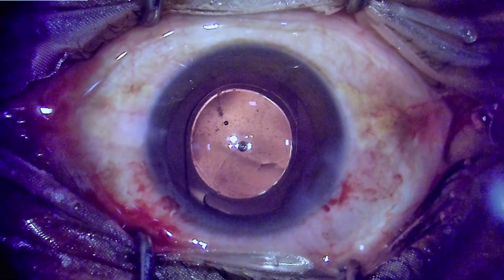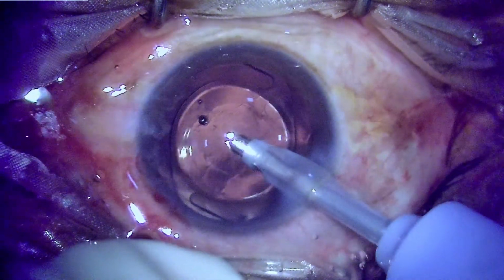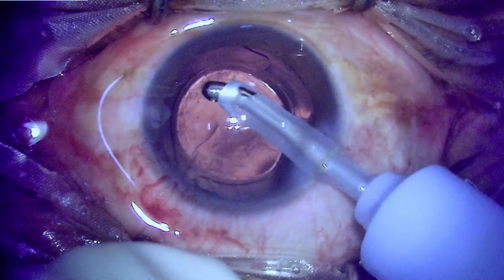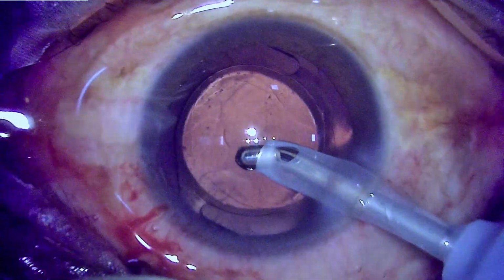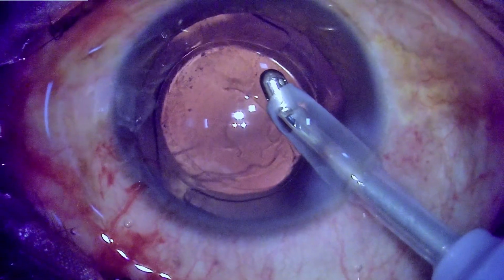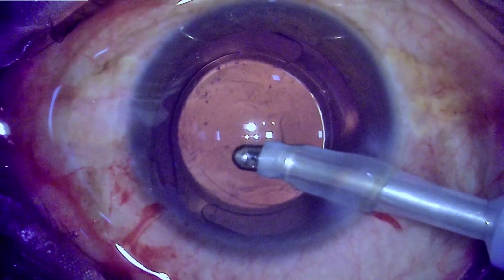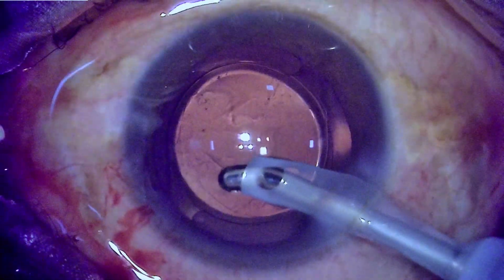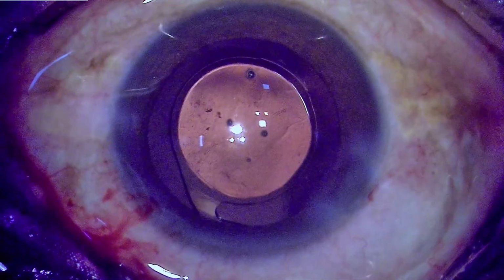So the IOL has been implanted and we can appreciate the glow, and this surgery has been done under minimal oblique illumination and just the retroillumination was used, which is relatively a dim light, but because it is reflected from the retinal surface, it provides a very good view and contrast of the refractile media, the lens fibers, the capsule, each one of the structures which is handled here in an immature cataract. So the viscoelastic is removed, and now it is time to form the anterior chamber and seal the anterior chamber.